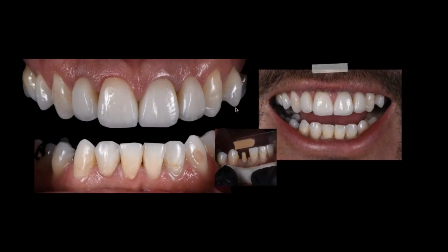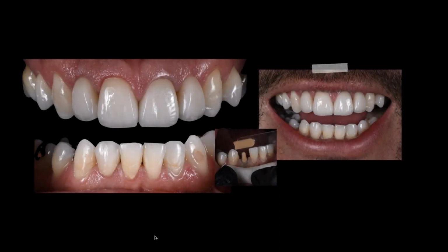And intraoral, when we put them in, they all kind of blended fairly well. And there was one other restoration done on the lower, the number 26 here. You can see this is a zirconia fully layered restoration with a very dark prep shade. So why did I use the more opacified zirconia? Because I needed opacity to hide some of that dark prep shade behind it.